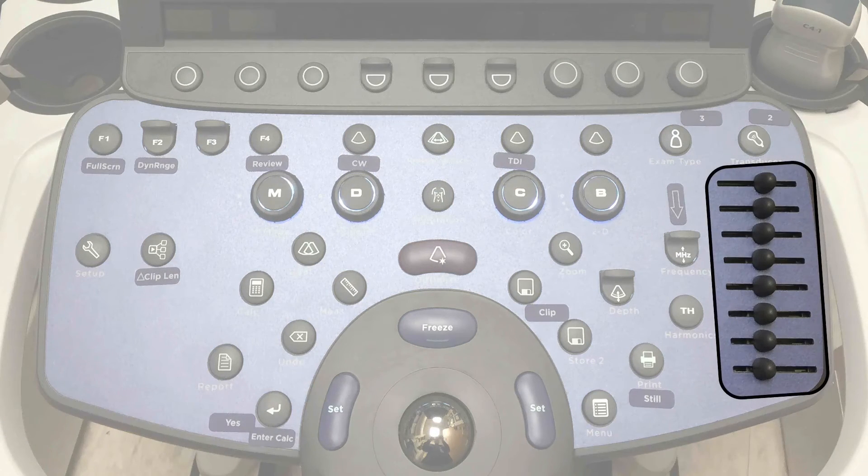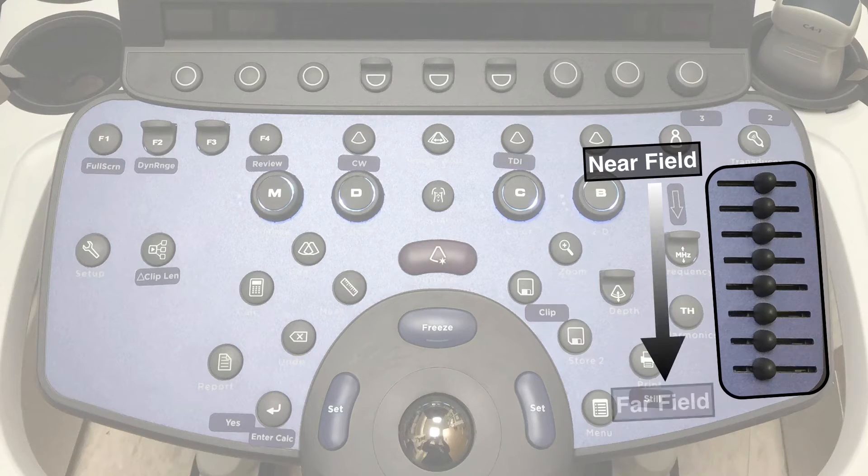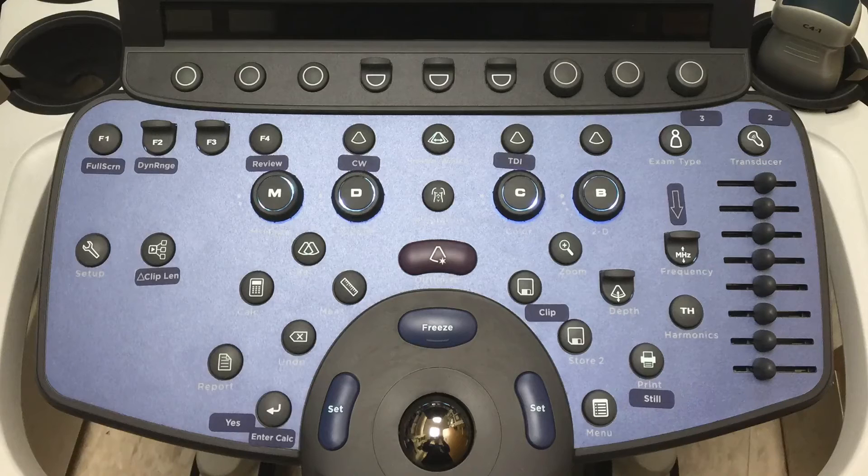You also have the option of using the time gain compensation sliders to change the gain. The near field is at the top and the far field is at the bottom. As you slide each slider to the left or right, you will increase or decrease gain for a section of the image. That is how you optimize your image — adjusting first for frequency, then depth, then gain.